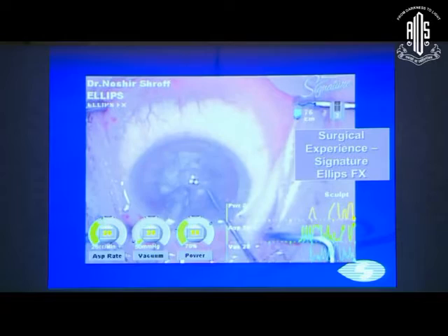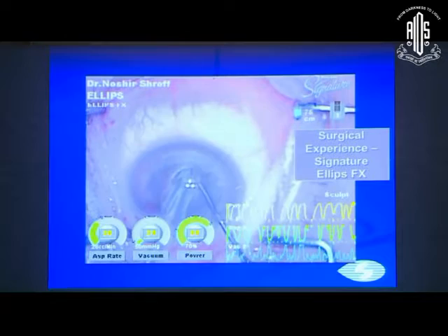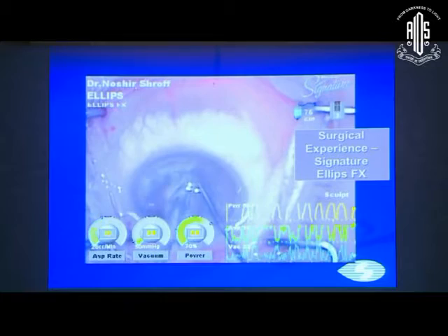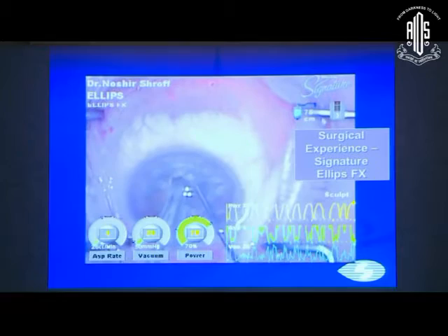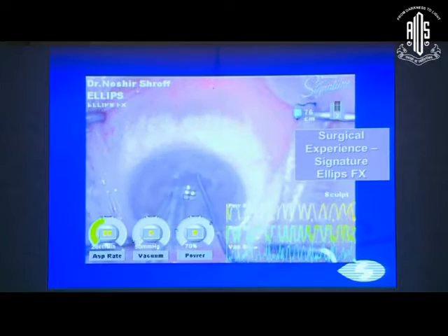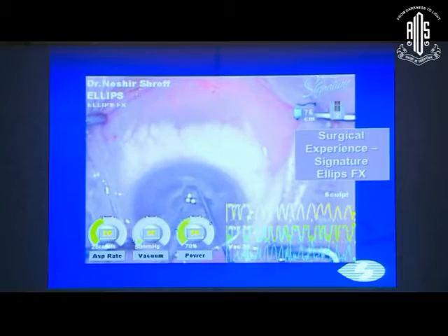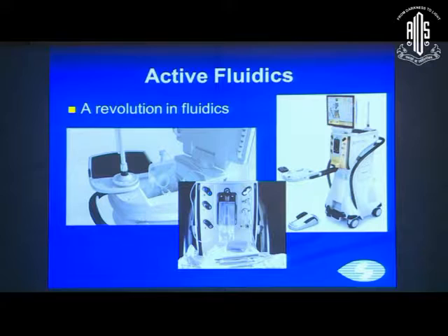A video clip demonstrates a very hard dark brown cataract being emulsified with the Signature machine, using a four-quadrant technique. Despite the cataract being dense and black, the cutting and emulsifying power is excellent. With vacuum set at 400, the chamber remains rock steady due to the occlusion mode and CASE technology present in this machine.